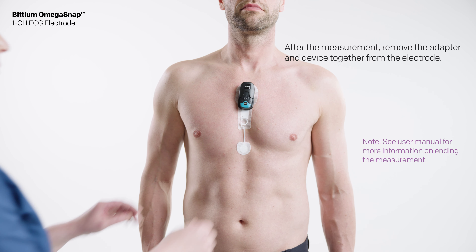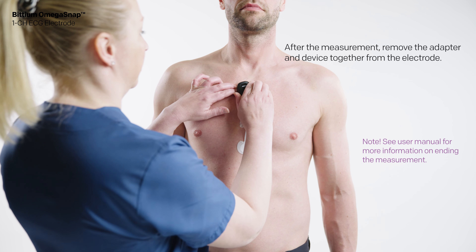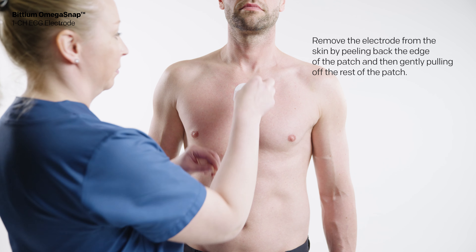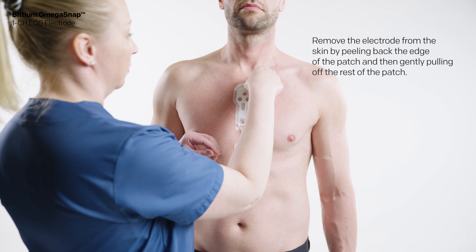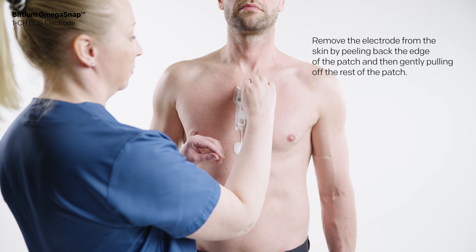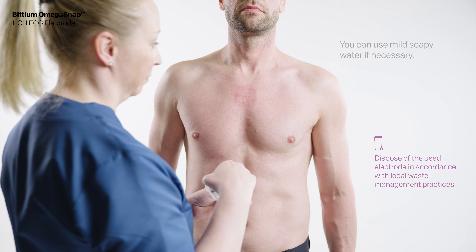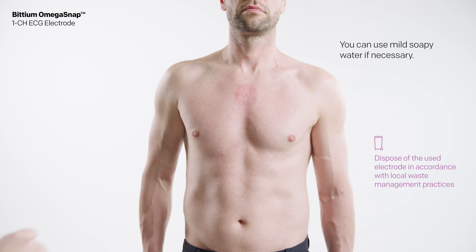After the measurement, remove the adapter and device together from the electrode. Then remove the electrode from the skin by peeling back the edge of the patch and then gently pulling off the rest of the patch. You can use mild soapy water if necessary.